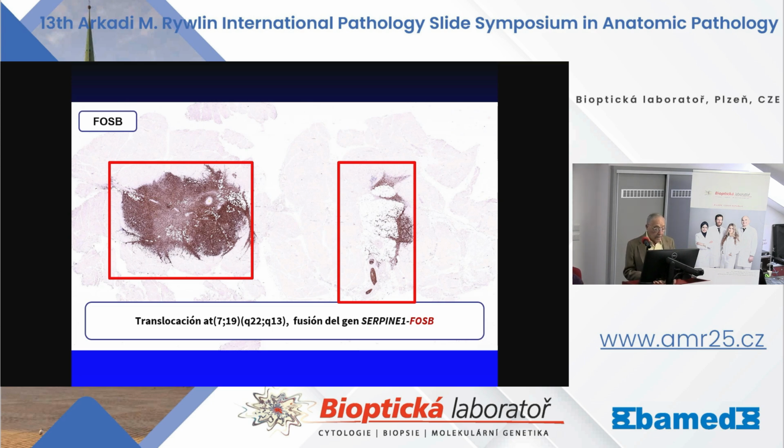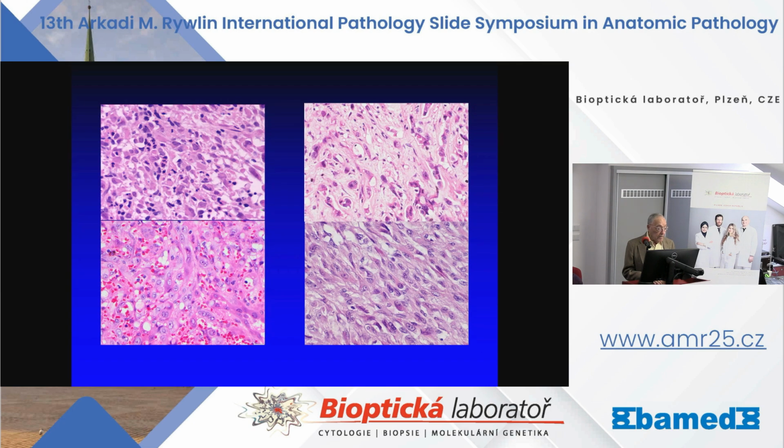Later was described the fusion of the gene FOSB with several partners. SERPINE1 was one of them. And this is morphology. It's very similar to our case.